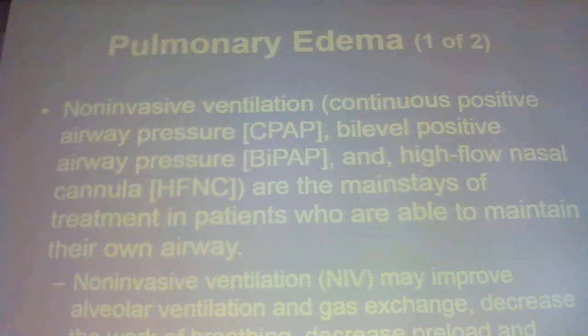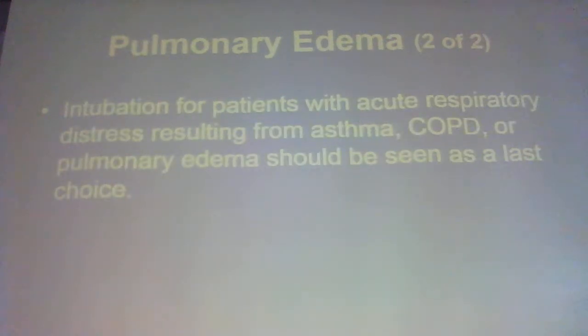So some ventilators, transport ventilators, will do BiPAP, but mostly we do CPAP in the field. So our goal in these patients is not to intubate them. That's why we invented CPAP. That's why it's a BLS skill.